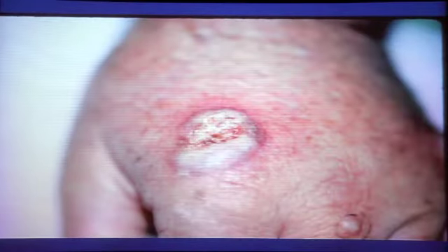Another example. And another one here. So these, as you can see, can simulate pyoderma gangrenosum or other things, Sweet syndrome. The biopsy usually shows this epidermal hyperplasia, again with the pallor, and as we go to higher magnification, we're going to see there's ballooning there, and usually a very, very dense infiltrate. Neutrophils, lymphocytes, some eosinophils in here, and all of this is ballooning degeneration once again.